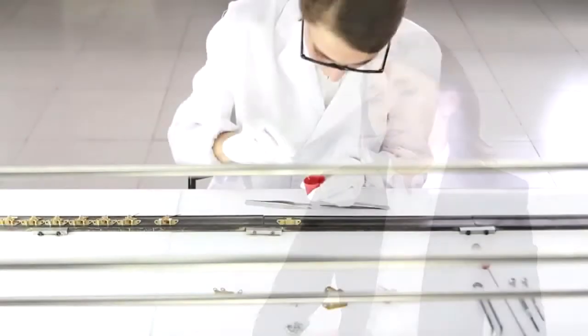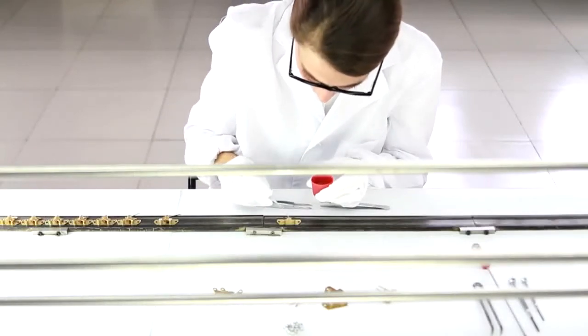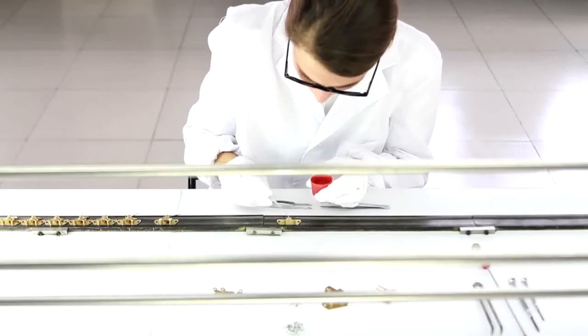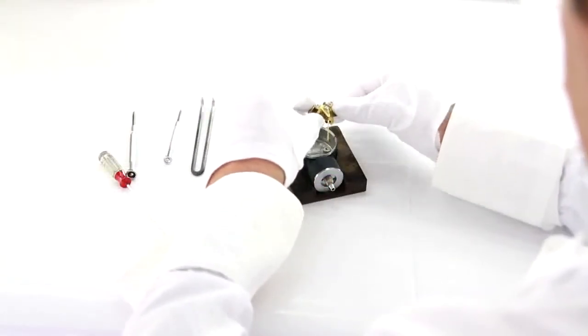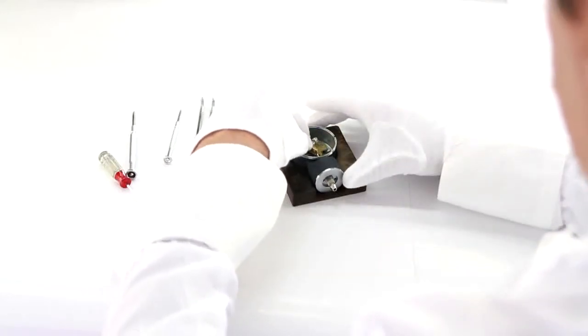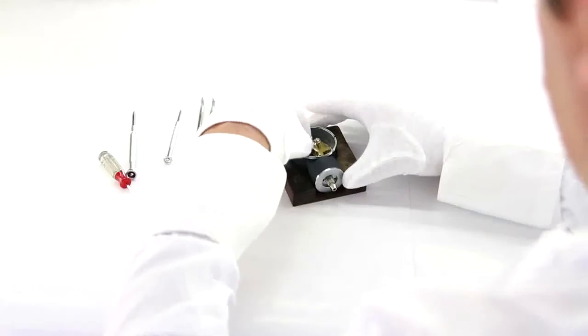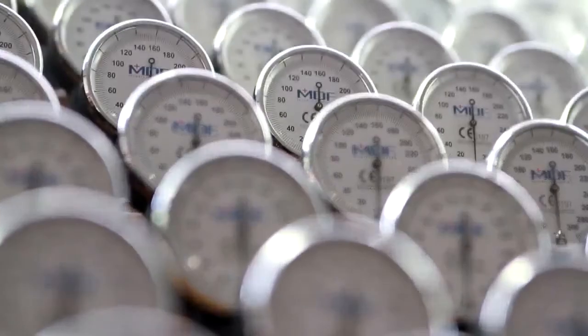All these high standards for precision and quality — what does that mean to the medical professional who uses our products? It means that we're able to offer accurate, reliable, premium medical devices with unrivaled warranties. All MDF sphygmomanometers come with a lifetime calibration guarantee on the gauge and a three-year warranty on the entire unit. That's what you get with all MDF products: high quality, handcrafted medical instruments with the best warranties on the market.